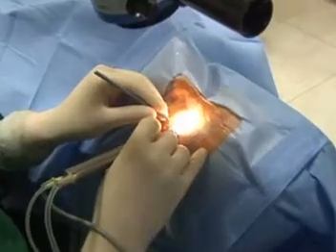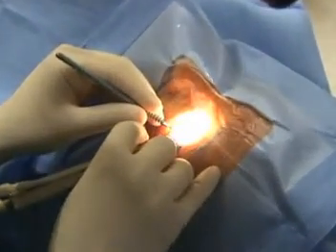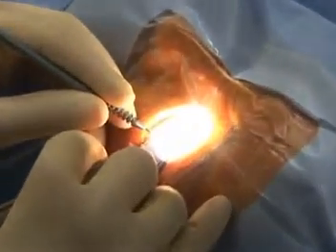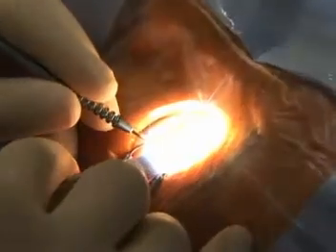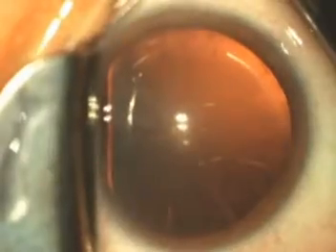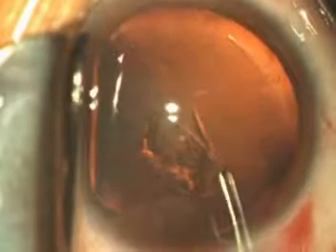When we perform cataract surgery, an operating microscope provides an unobstructed view of the intraocular structures such as the cornea, the iris, the lens, and the lens capsule.